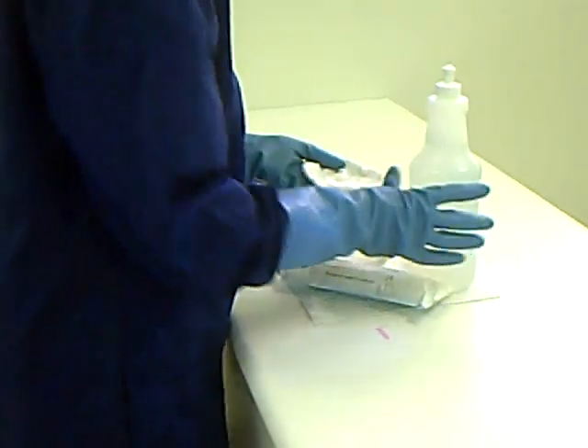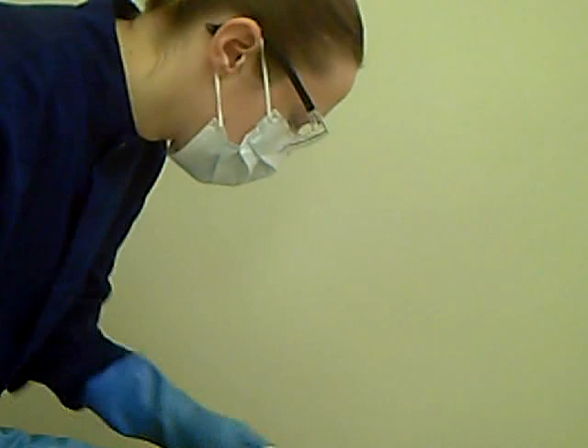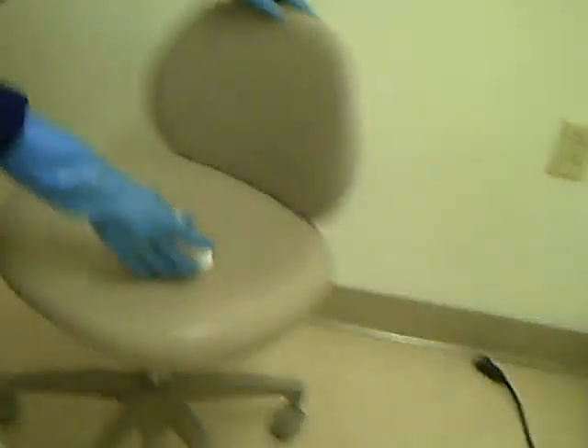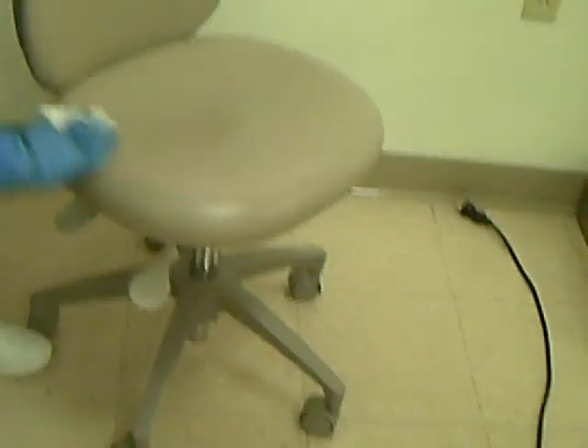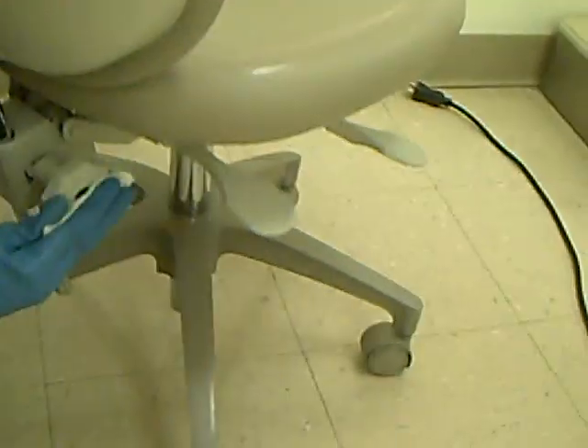After the patient's chair, start with the operator stool. Wiping from top to bottom of the back support and the seat, including the paddles, the adjustment knobs, and the pole.